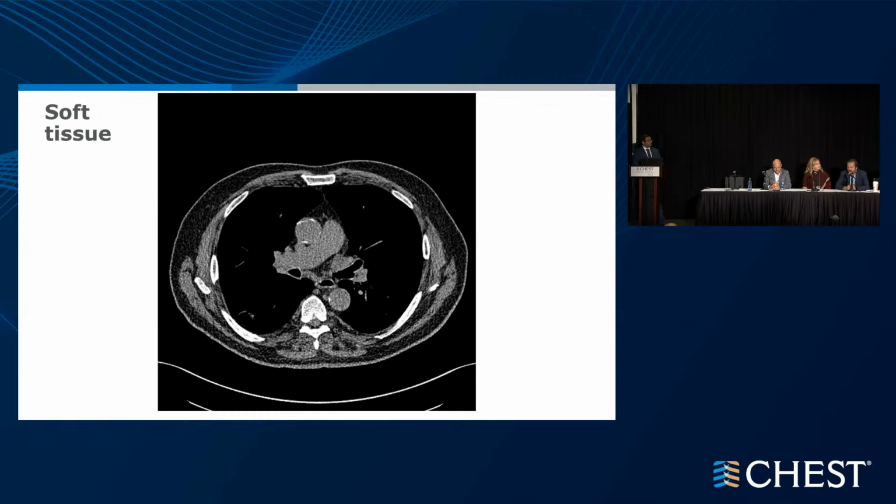And this is also tricky because most synchronous primaries are of the same histology. And so the fact that they're both different in appearance and relatively similar in size, right now I'm leaning towards these being synchronous primaries just based on those factors, but certainly I'd like to get biopsies of both. Yeah, absolutely. I think that's very reasonable based on everything you said.